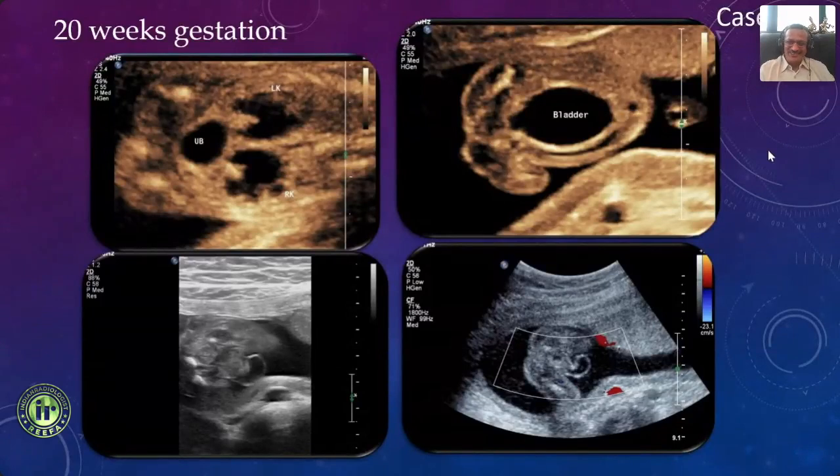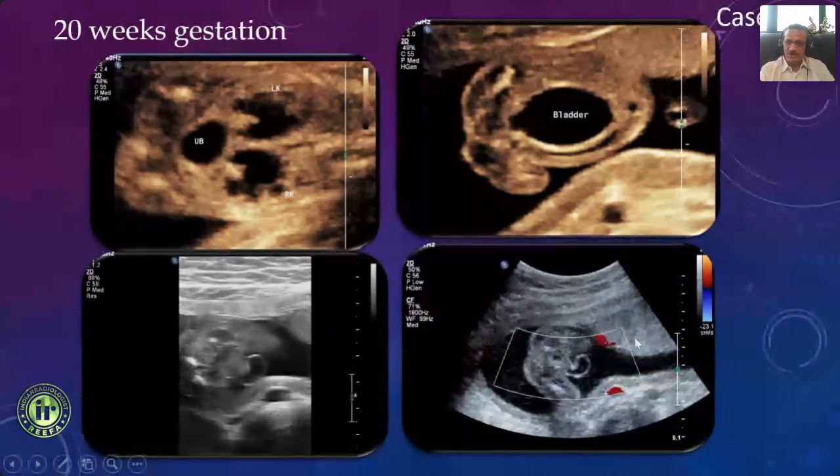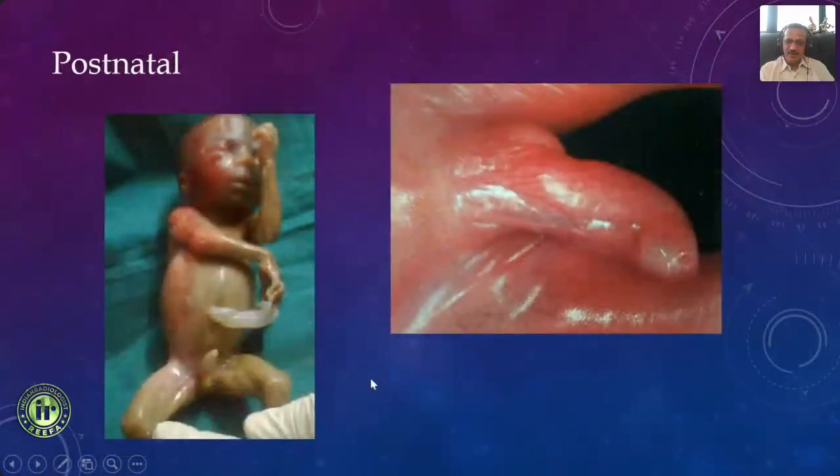Okay, great. So who is that? Pradnya has answered this as megalourethra. Fantastic. Congratulations. What is very unusual is if you see an obstructive uropathy, we need to go right up to the cause. Here we feel it's a posterior urethral valve, but when we look at this structure, that's the penis, and it is not a cord because there's no color flow, and that's a congenital megalourethra.